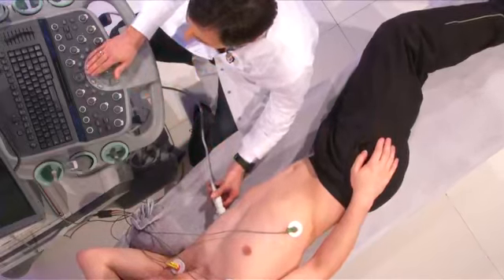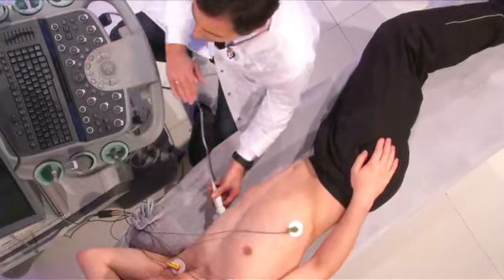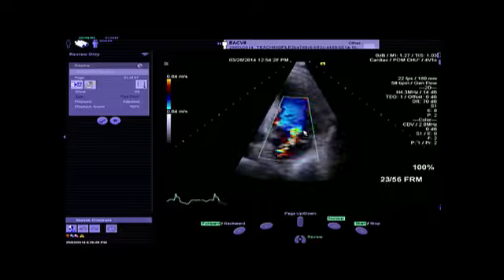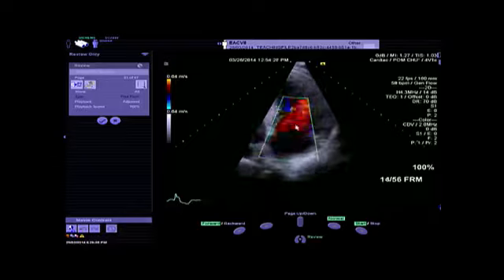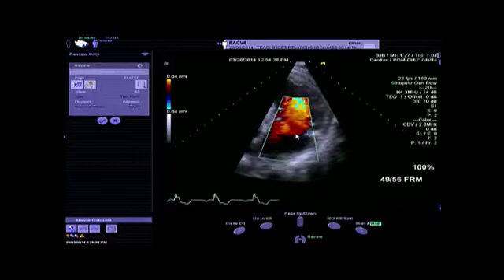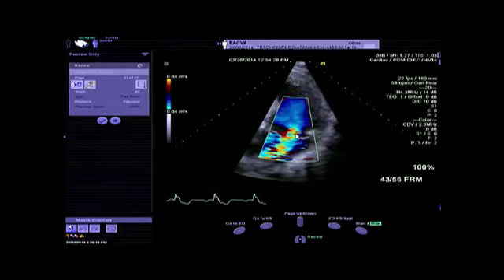So now again I will change and I will go to the apical view, showing you exactly what we have with the four-chamber view, and here you have a beautiful jet that is related to the regurgitation, and clearly you can see here the convergence zone, the constriction of the flow, and the extension of the flow into the left atrium. For sure, if you want to analyze the color flow mapping here and evaluate the regurgitant jet area, it will be very difficult.